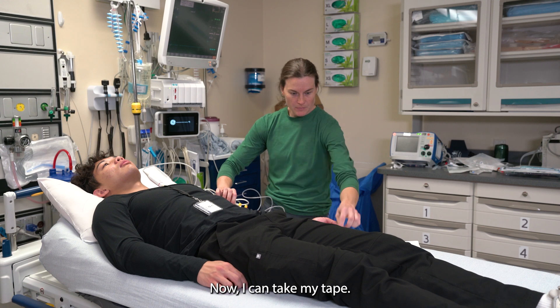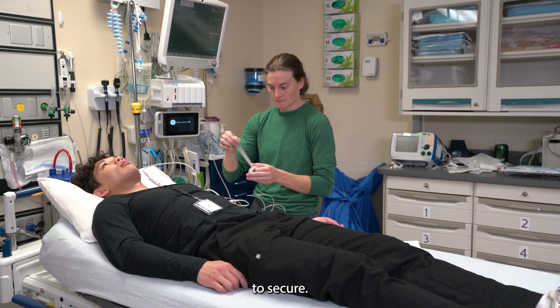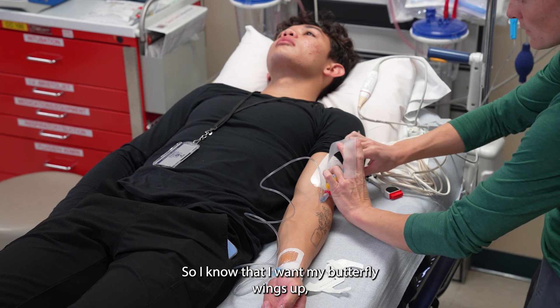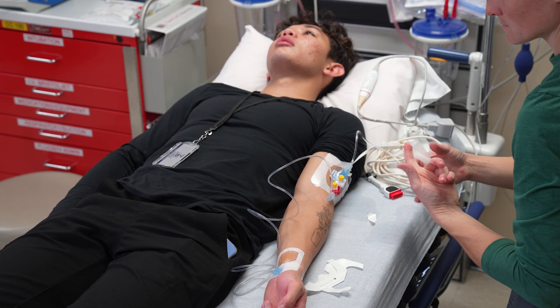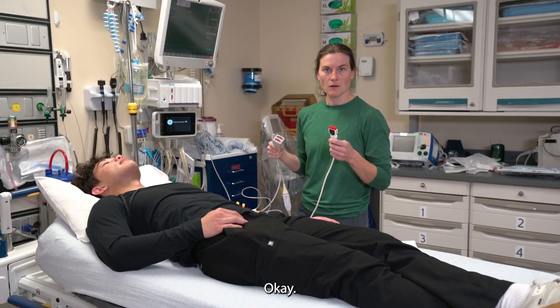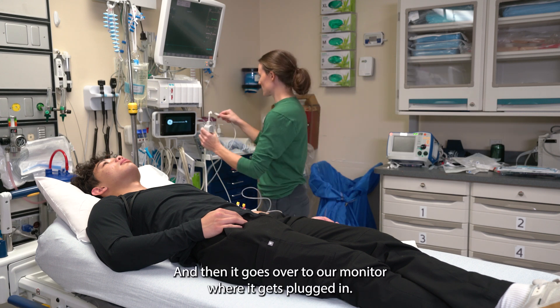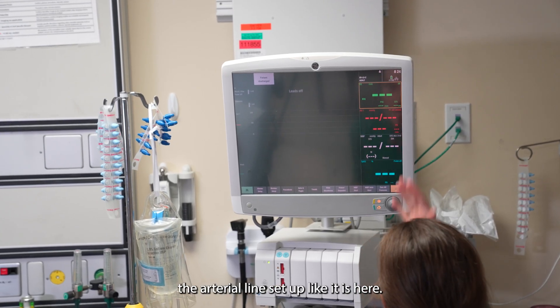Now I can take my tape — just regular old tape — and get some strips of it to secure. I know that I want my butterfly wings up, so I'm just going to tape right over that connecting piece. Now that we have everything secured, we are ready to plug into our monitor. To do that, we grab our adapter and our cable, plug this in, and then it goes over to our monitor where it gets plugged in. We should see the arterial line set up like it is here.